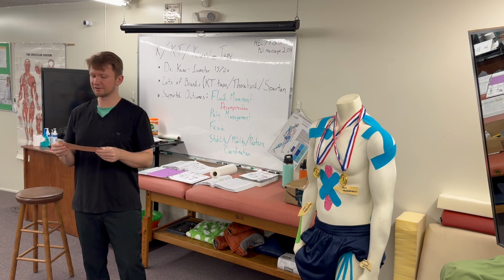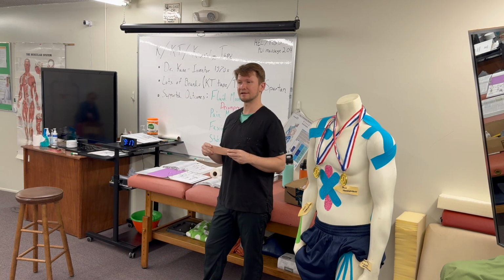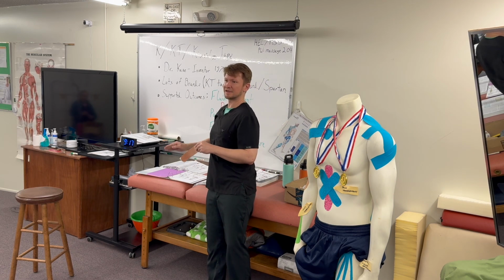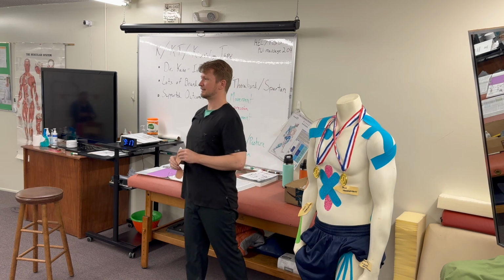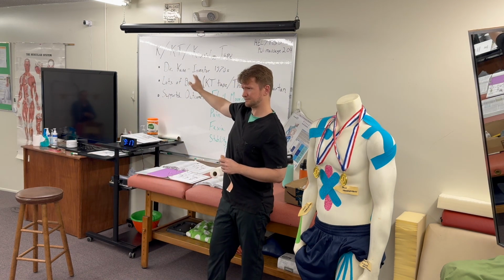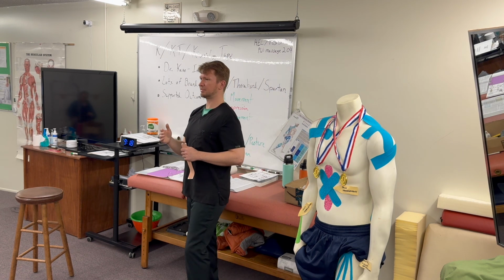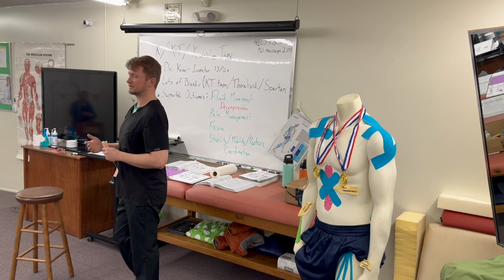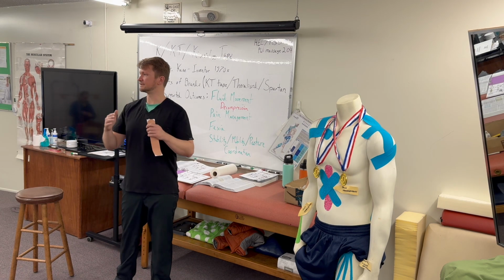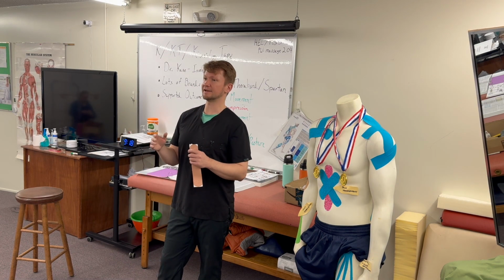The other brands, if I'm going to tell you just right off the gate, the brand that I think is the best quality, it is the OG original KT tape brand. And that is the brand that was founded by Dr. Kase. And he was a Japanese chiropractor, I believe. This was developed in the 70s. And then steadily has just gotten more refined and more popular, especially when it was seen in the Olympics.